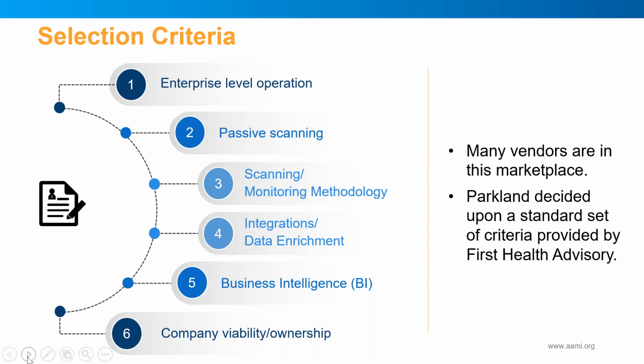Some of the biggest things that we saw early on when we were evaluating these systems was the information that was coming across our network from these devices. By them doing their passive scanning and monitoring our technology, it wasn't just identifying the devices for us, which is a huge improvement, but it was also providing back information such as software revisions, serial numbers, security patches if there were updates needed.